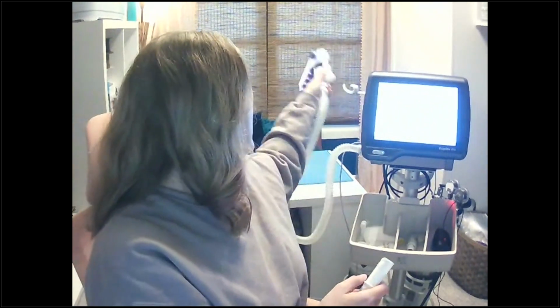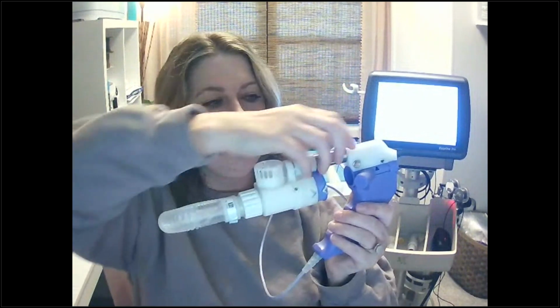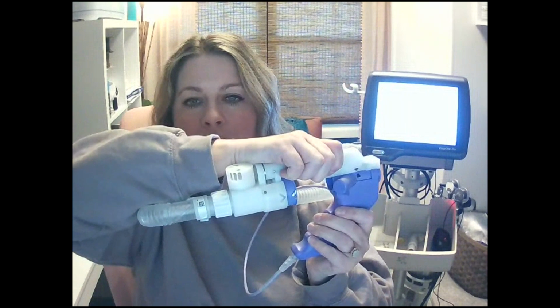All right. So to disconnect our handle from our motor block, there is a silver button. We're going to slide that until those arrows are lined up on top of each other, and then lift that off. Make sure that we always line up the arrows before we lift the motor block off, just because that can bend our pins.